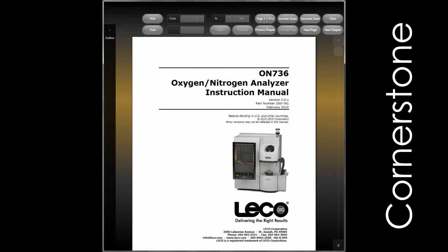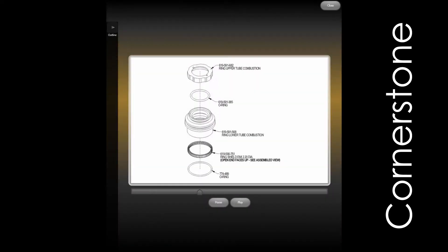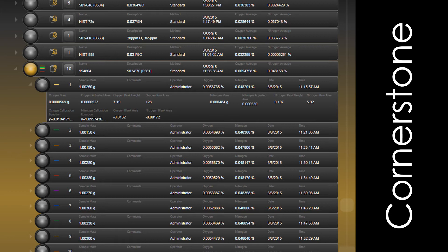Advanced diagnostic features include a thorough digital onboard manual, maintenance animations, photo illustrations, and screen captures so that you can get the direction you need without having to refer to multiple manuals.